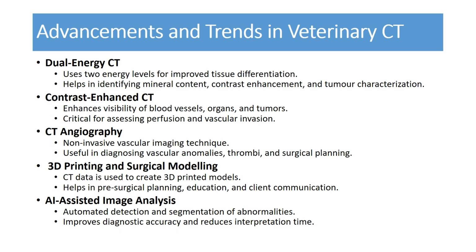Contrast enhanced CT is another advancement that enhances the visibility of blood vessels, organs, and tumors, critical for assessing perfusion or vascular invasion.